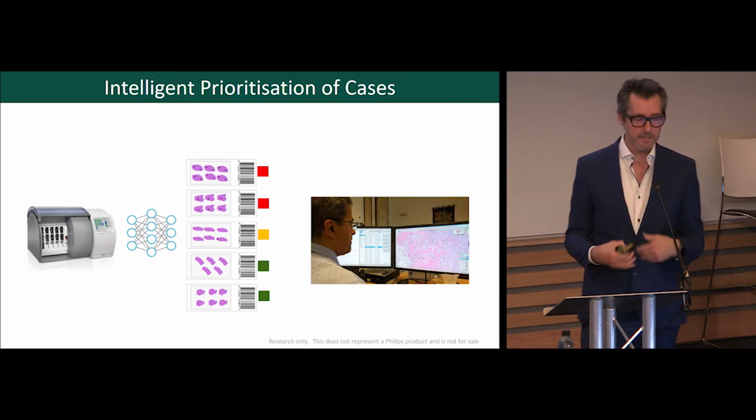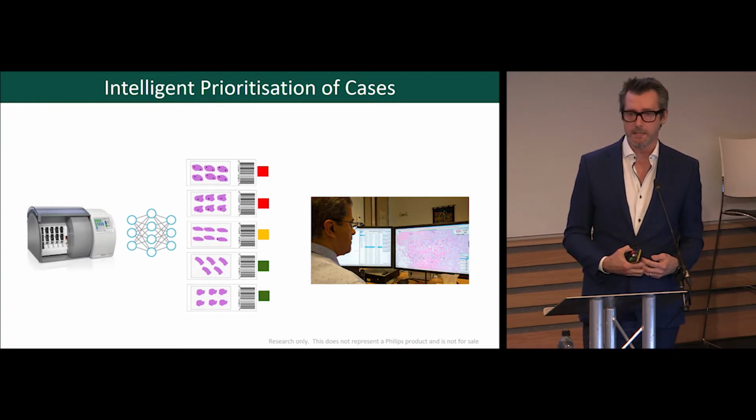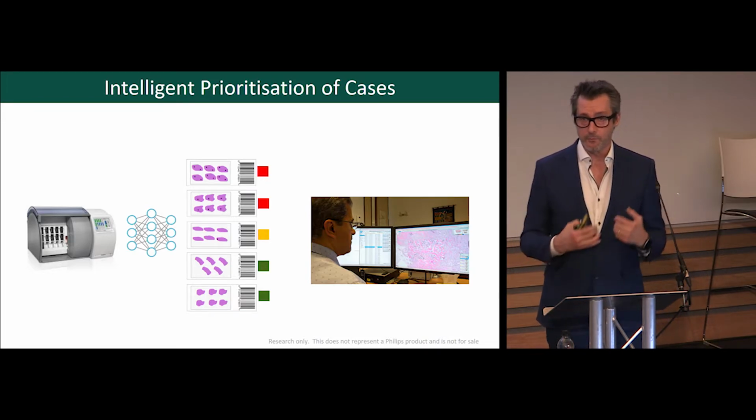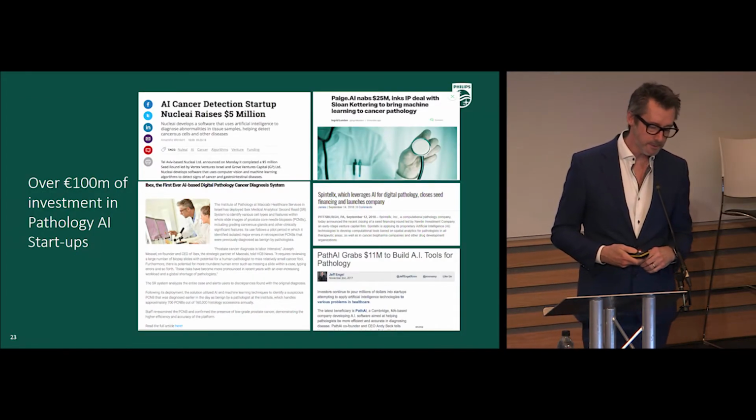And the pathologist can then review those cases that are much more likely to contain metastases than others, which are detected to be absolutely normal. And this type of approach to using deep learning in routine diagnostic practice will have a significant impact on performance.